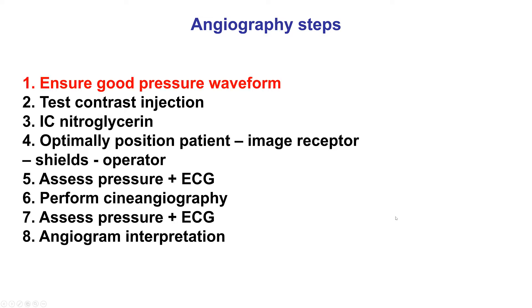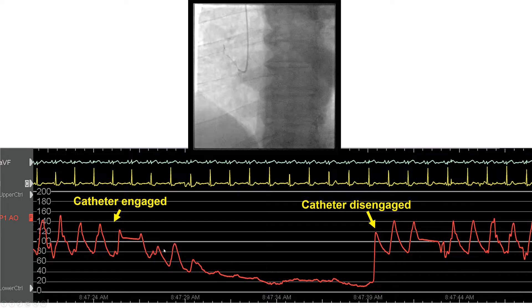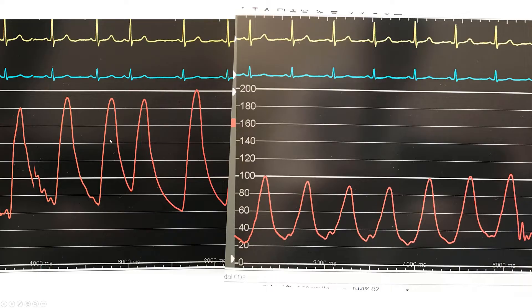Starting with step one, ensuring good pressure waveform. This is critical before any contrast injection. The reason is that if there is dampening, like as in this particular case, then contrast injection can lead to dissection or cause arrhythmias or other complications. So good pressure waveform is critical before injecting contrast. We want a nice pressure waveform without dampening before contrast is injected.